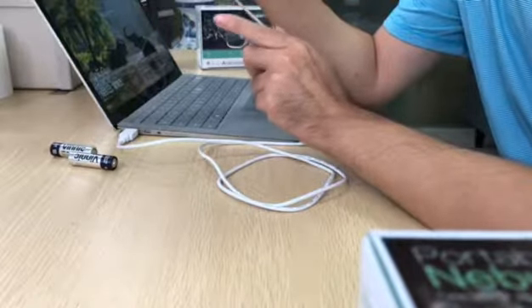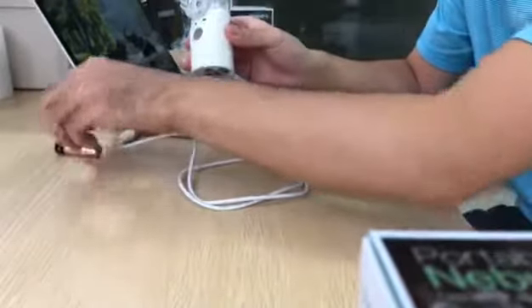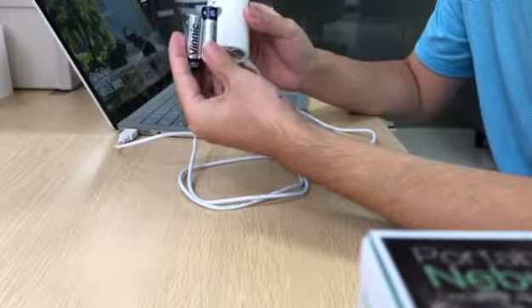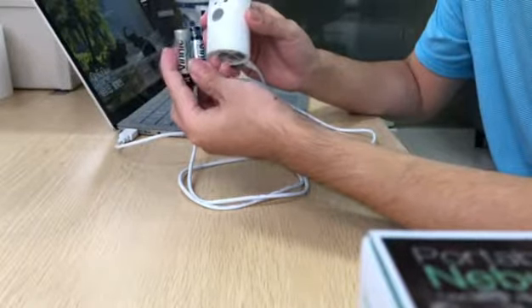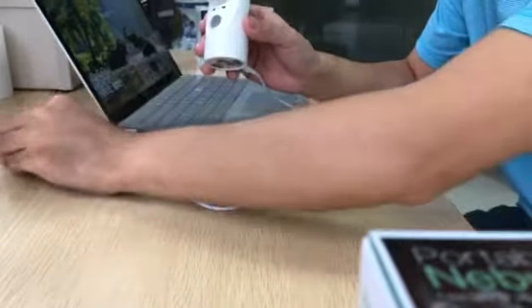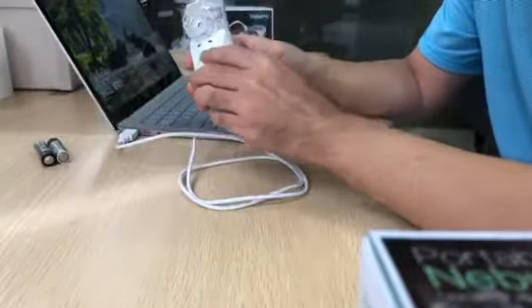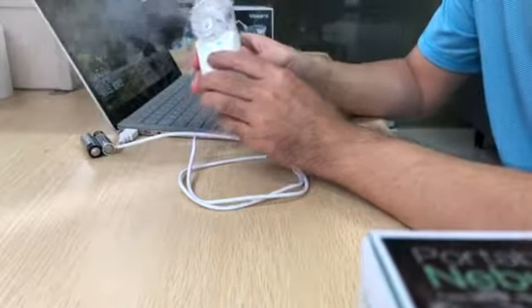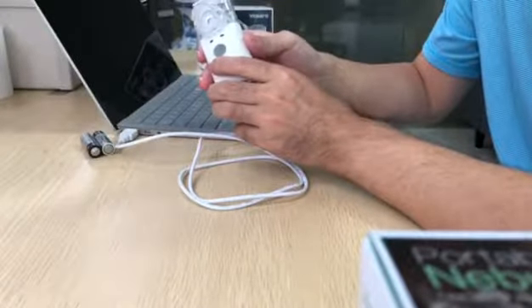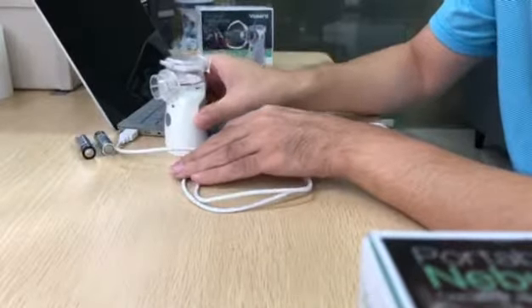For the troubleshooting, if the nebulizer can work with the USB cable but cannot work with the battery, that means the battery is not powerful enough. You can change the battery. That's the troubleshooting for when the nebulizer cannot power on. Thank you.